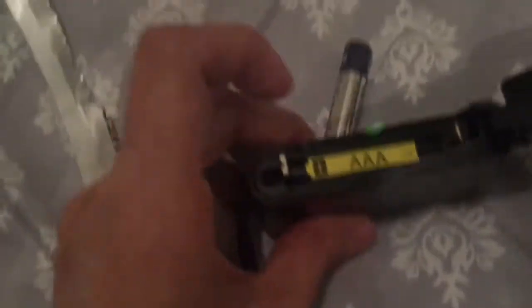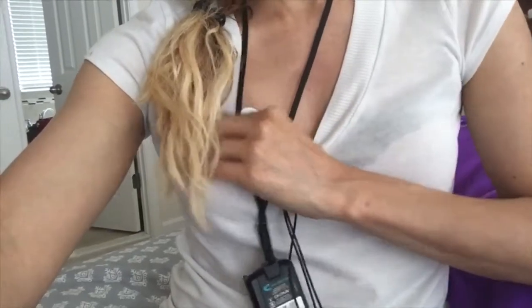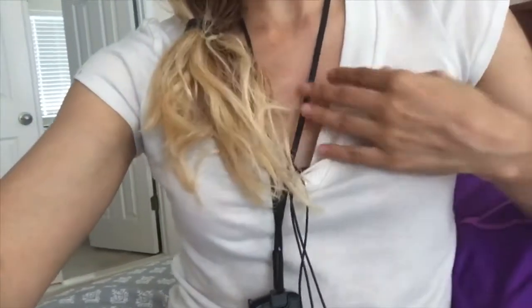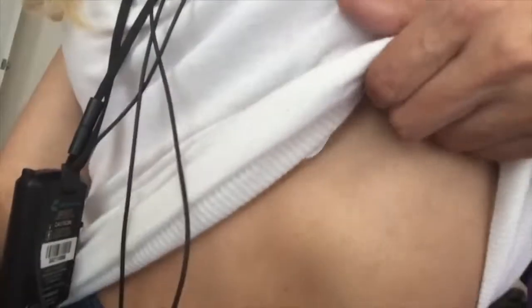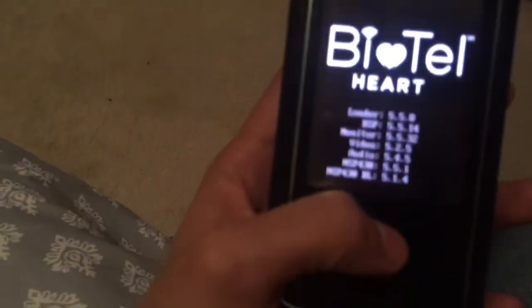I'm going to insert the battery into this device, which I put on my neck. I placed the battery already, and now I need to first clip this onto my sticky electrodes on my chest and then turn it on. This is how it hangs over my neck — I have two electrodes up here on each side and one on my lower left. All I need to do now is turn this on and then it starts.